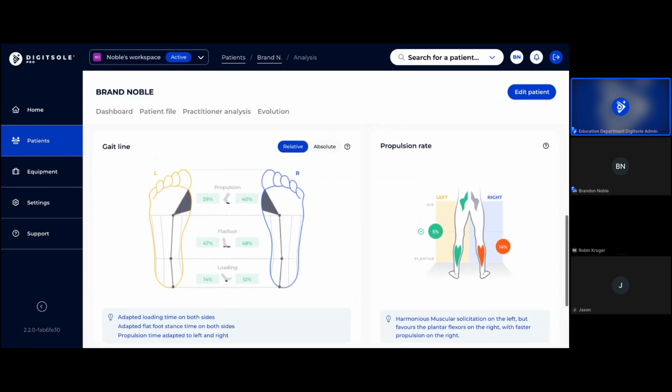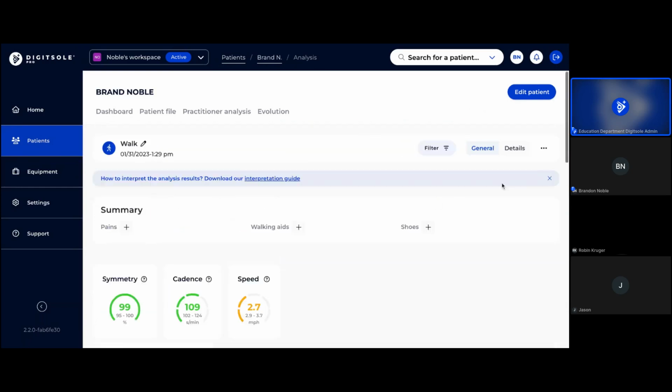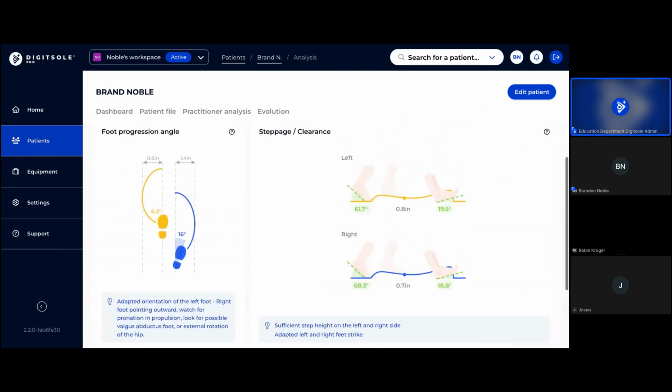Of course, in that foot progression angle, we did see another strategy to reduce torque on the spine by just kind of dangling that through. We know that position and that amount of circumduction is like FABER's position: flexion, abduction, external rotation.